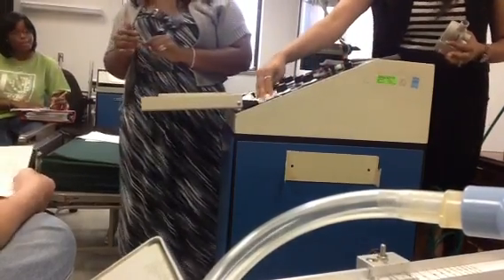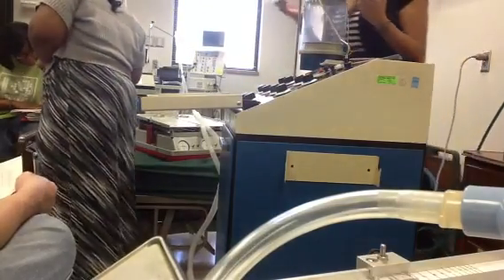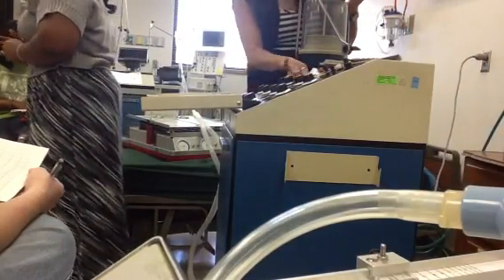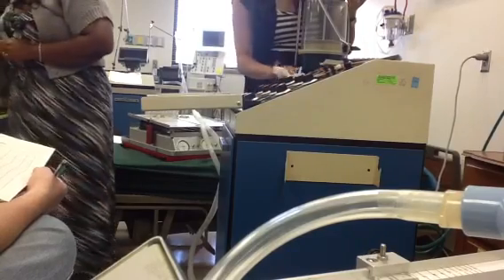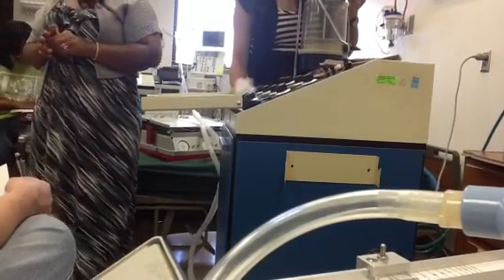1 to 3. Yeah, 1 to 3. Sensitivity. Y'all did I time and E time. You know how to do E time. Total cycle time, subtract the inspiration from the cycle.